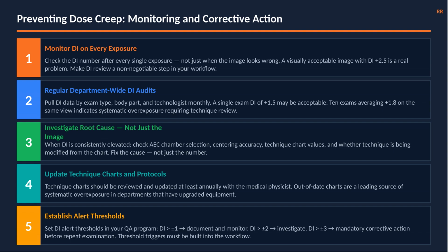DI beyond plus or minus 1: document and monitor. DI beyond plus or minus 2: investigate. DI beyond plus or minus 3: mandatory corrective action before repeating the examination.